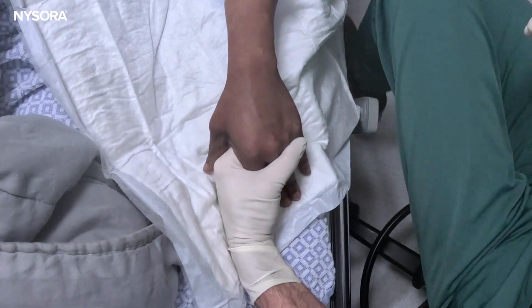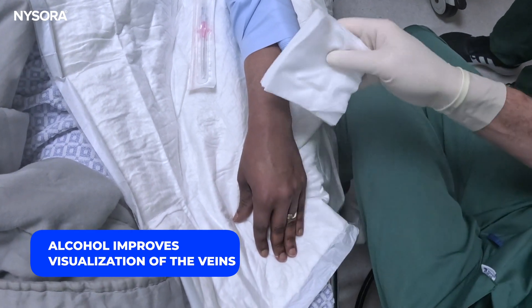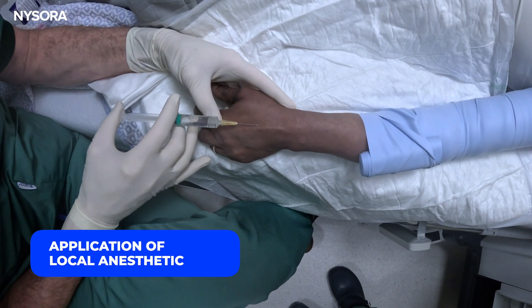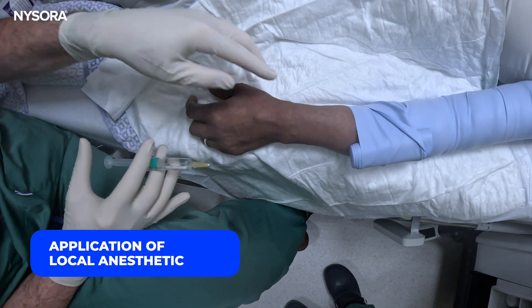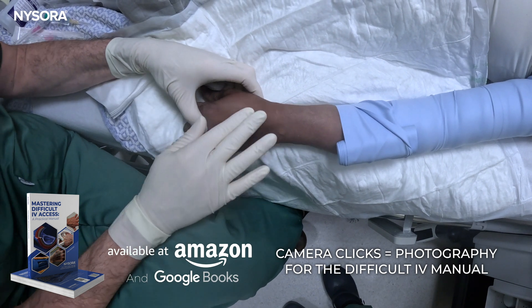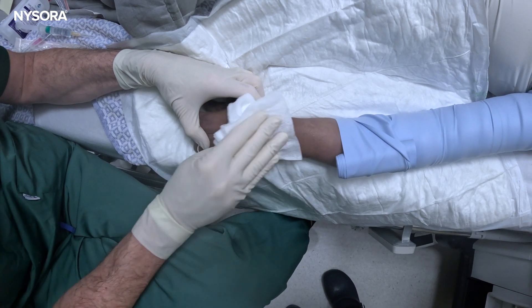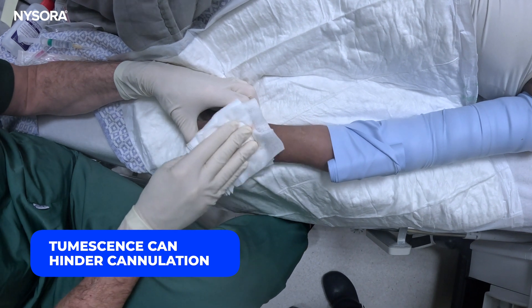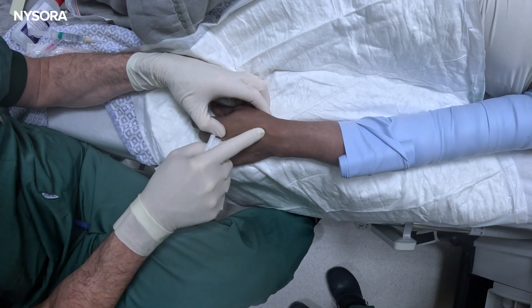With this kind of vein you definitely need to use a very fast access to get through the thickened wall, because this vein has been abused a number of times. Let's do some alcohol preparation — the alcohol will help the vein shine, which will help us with visualization. Then a little pinch for the local anesthetic. I'm going to massage this a little bit to distribute the local anesthetic and avoid tumescence, because tumescence can make IV cannulation more difficult. The local anesthetic infiltration may make it more difficult to see where the vein is, but here we can see it.